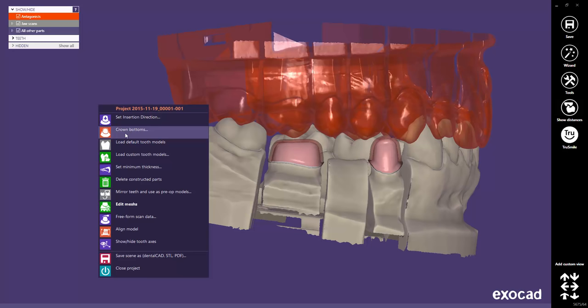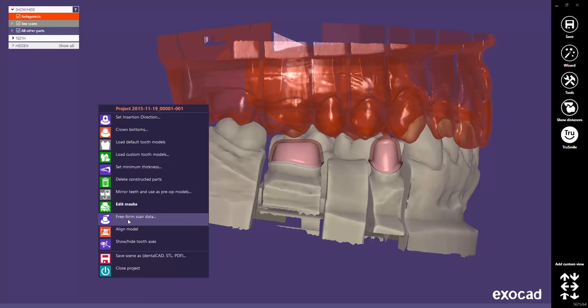In the right mouse context menu, you will find not only all the work steps available at that stage, but also additional functions like the Edit Meshes feature, the Free Form Scan Data feature, or the Show Hide Tooth Axis feature. And here too, as you proceed with the design, the list will become more and more populated.